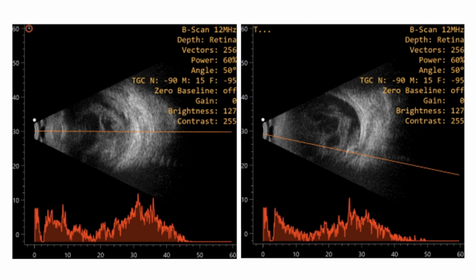Positioning of the foreign body. Okay, so what do you mean by position? If it is in the mid-vitreous cavity or it is close to the retina. Correct. So how will you know it on ultrasound? Sitting position and lying down position. Yeah, even eye movement. So you will know whether the foreign body is moving in the vitreous cavity or it is impacted on the retina. Yes. So that is very important for planning the surgery.